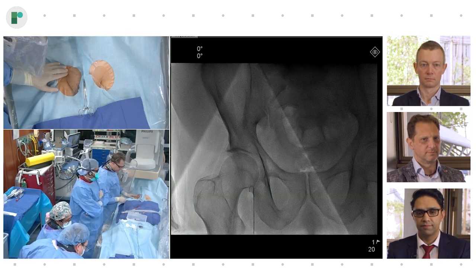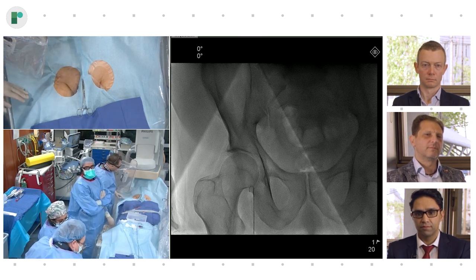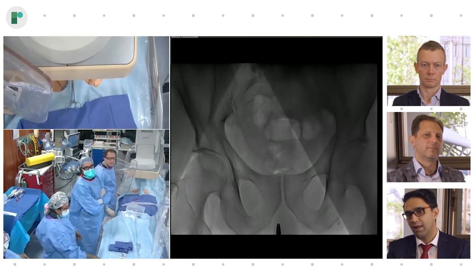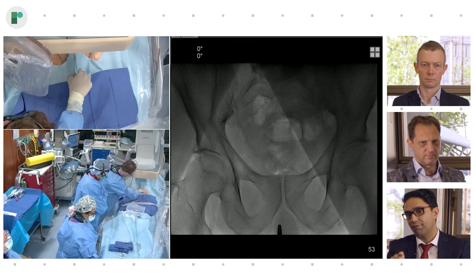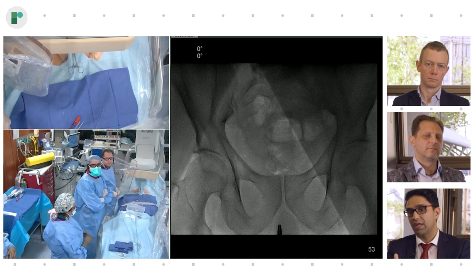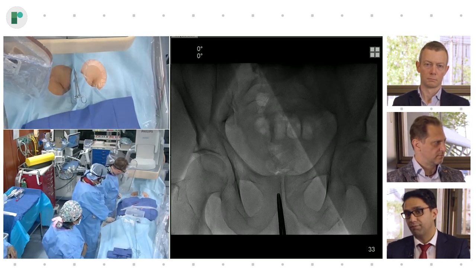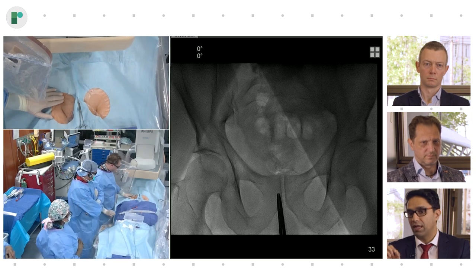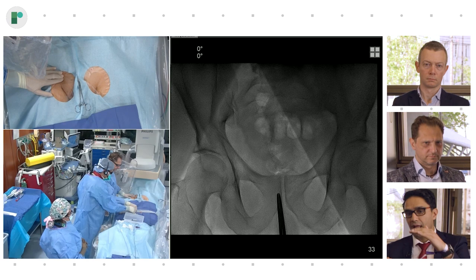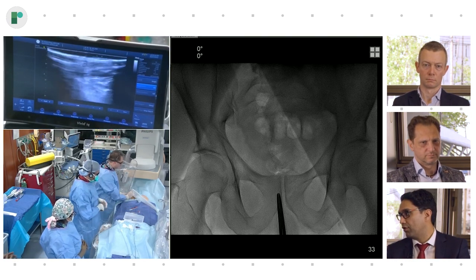Okay, so that's that. I have actually a pretty good pulse here. You want a fluoro, Alan, and show them the mosquito that it's in the right position? I think it's a little bit too low. Yeah, we can adjust it if we need to. So this is exactly what we're saying with the hybrid approach. You see, we've marked the bifurcation with the hemostatic clip. So what that tells us is the bifurcation is very low in comparison to the femoral head. And so what we can do then is base our access in between the hemostatic clip and the mid portion of the femoral head. That way we make sure that we're above the bifurcation and below the inferior epigastric.